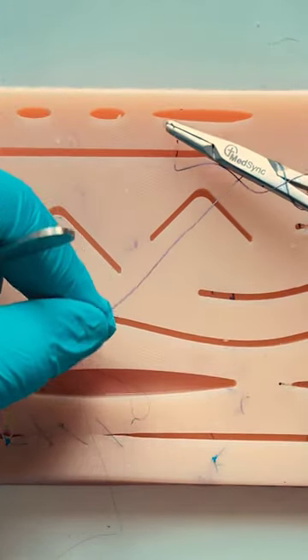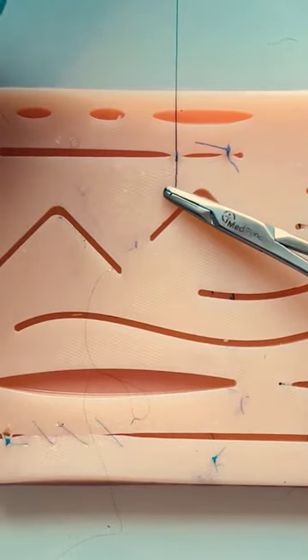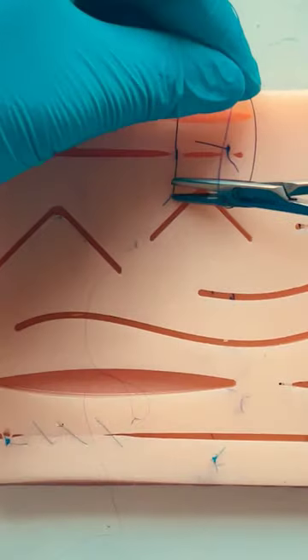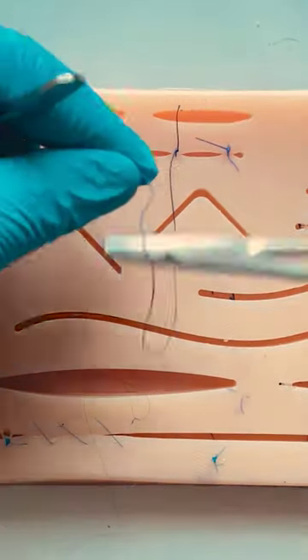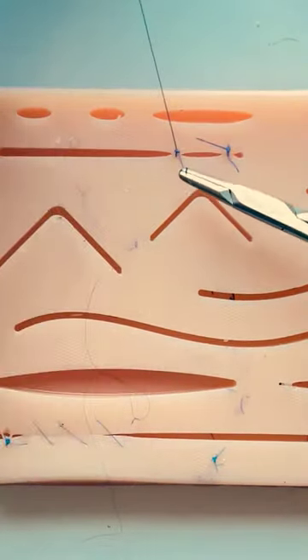When tying your knot, you do not need to apply maximum strength, simply enough force to bring the wound edges together dermis to dermis, epidermis to epidermis.